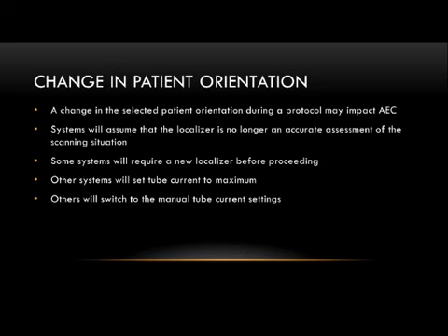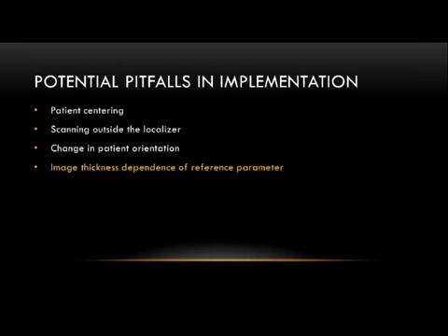I think a lot of this comes actually back to the localizer radiograph. It's a very, very important tool, and it's your friend. It's our friend. So we should make sure we treat it right and get good ones and appropriate ones for what we're going to be acquiring.